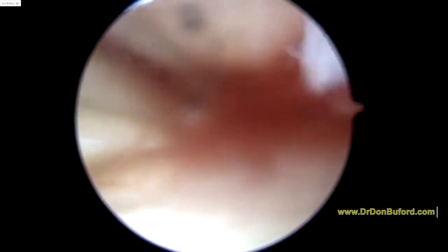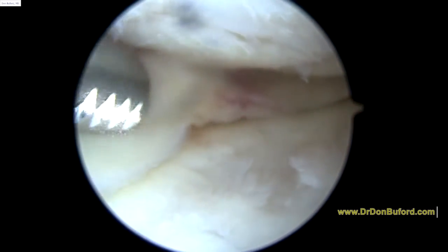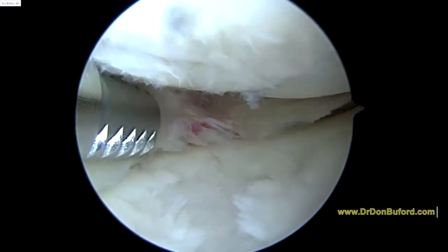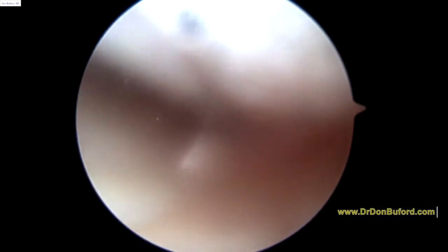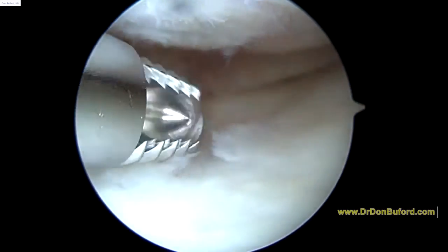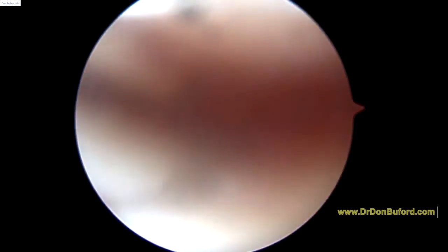Right now we're just really focusing on flushing a bunch of water through the knee, and then we'll slowly get a clearer picture. We're going to take a basket just to trim up some of that posterior horn. As we look at the tibial plateau, we can see some little cartilage flaps here too. We don't want to remove any cartilage if we can avoid it.